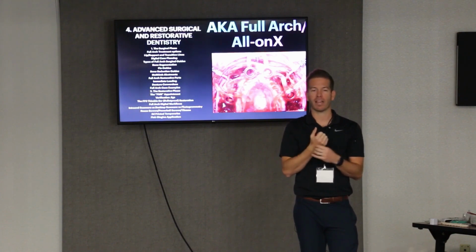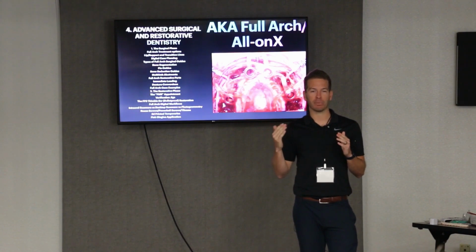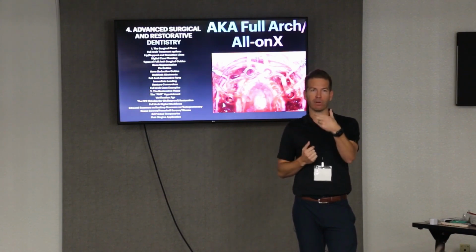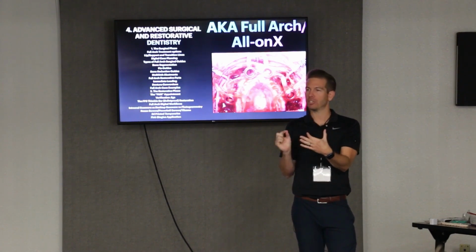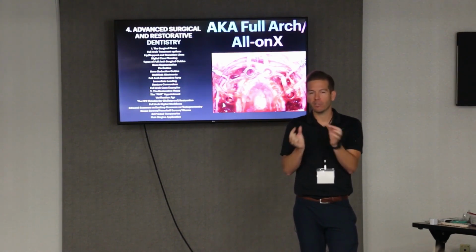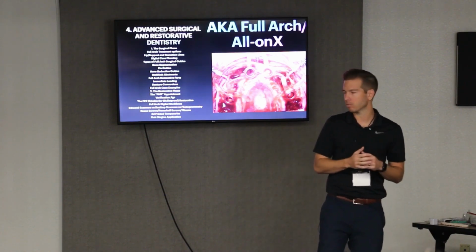So we want to take that mindset, but take it way further and actually predict, okay, on that final prosthetic, where is my screw hole going to be within each tooth? Because it's going to give you the thinnest, strongest, most predictable final restoration. That's what the patients want.